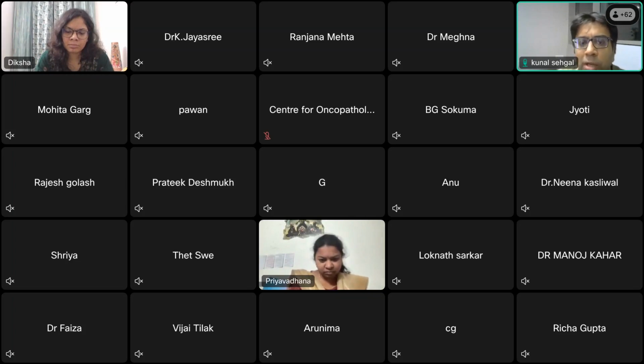or you will now become in charge of a lab where you have a CBC machine. Now, a very simple flag, for example, that plus sign means some value is increased, and a minus sign will say some value is decreased. Now, if I say hemoglobin 12, for male it is decreased, for female it is normal. So one, it is gender specific. Two, hemoglobin is age specific.